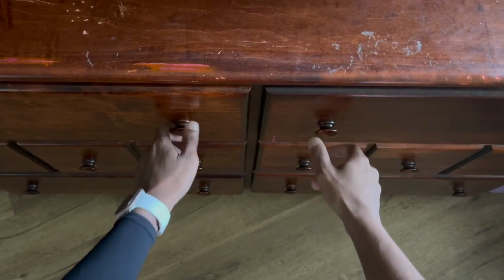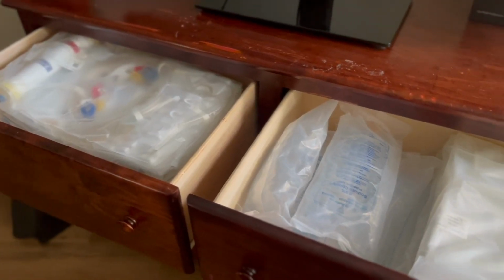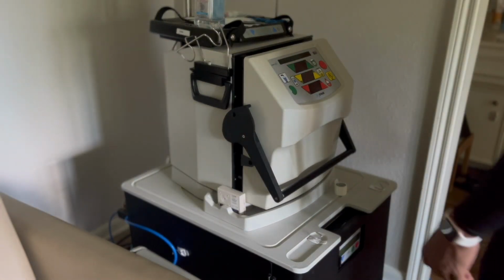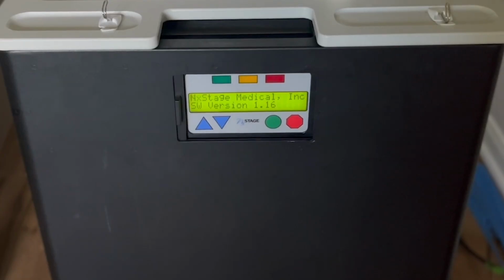So the first thing you see here is that I keep my supplies inside my dresser. On the left side, there's the cartridge for the dialysis. On the right side, there is the saline bag, and there's the SAK that I'm taking out. All right, and close the drawer there. There's a cycler machine, and at the bottom is a Pureflow that we just turned on. It's going to tell you some info about it, and then it's going to say that it's ready to start. It says press go with the green button.